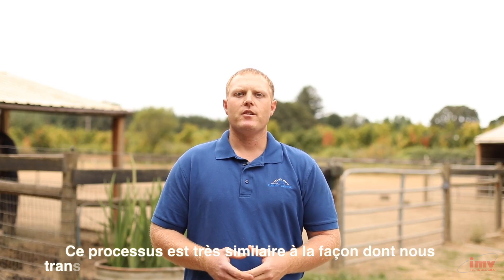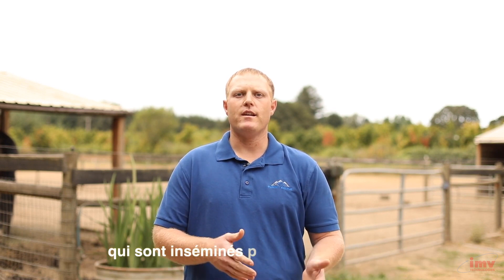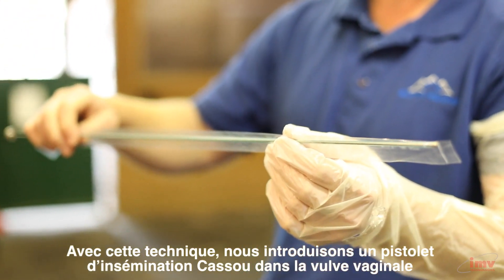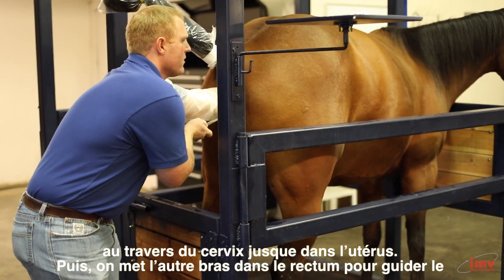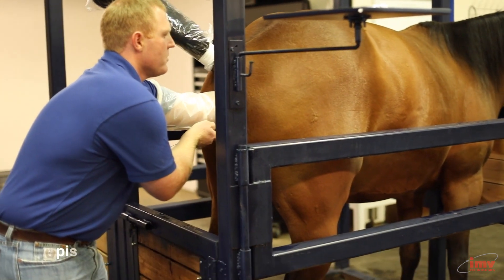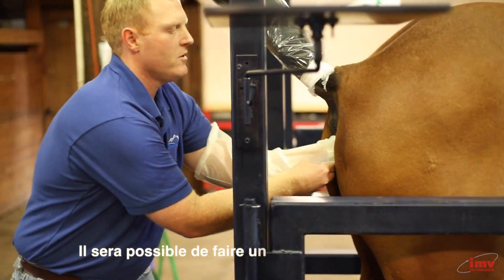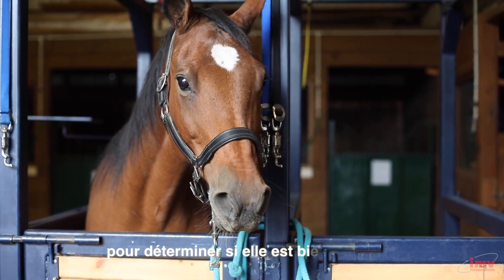This process is very similar to how we would transfer a traditional in vivo produced embryo, as though we bred and flushed and recovered an embryo from a mare. With this technique, we pass a casu gun through the vaginal vault, through the cervix, up into the uterus. We then go in rectally and guide that casu gun towards the tip of one uterine horn and gently deposit that embryo. We'll be able to do a pregnancy exam on this mare in the next four to seven days to determine if she's in foal.